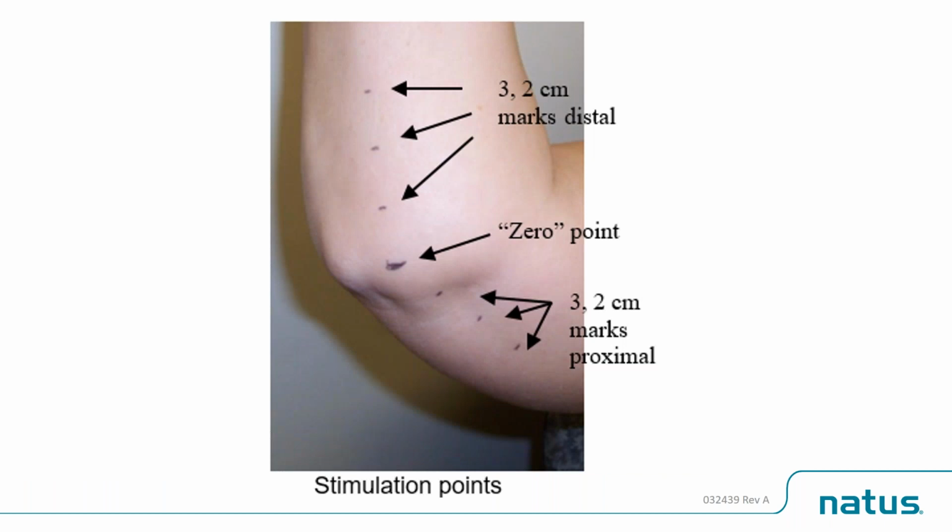And here's the inching. And again, this kind of shows a few pitfalls. You just have to be very, very careful. Look here at even my little lines there with the pin. They're different widths, so we have to be very careful about how we mark this so that we're consistent.